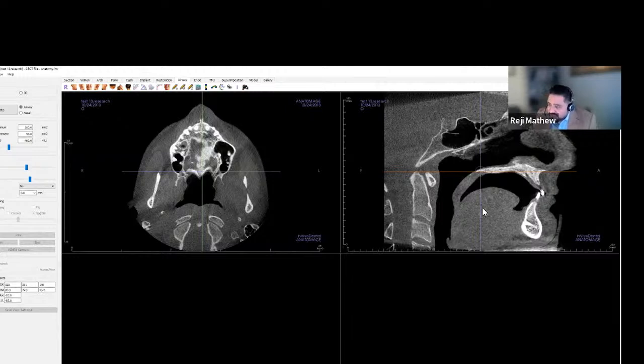That is what CBCT is used for, because tongue position, sometimes a bite block where the patient is biting, or the patient raising the tongue to the roof of the mouth, all change the airway space. Any dimensional change matters, and this is a very static image, whereas the airway is more dynamic.